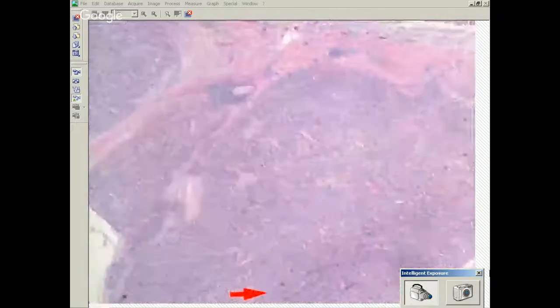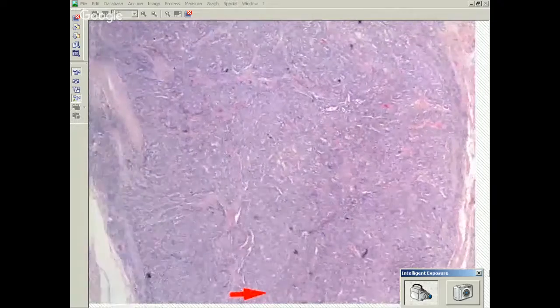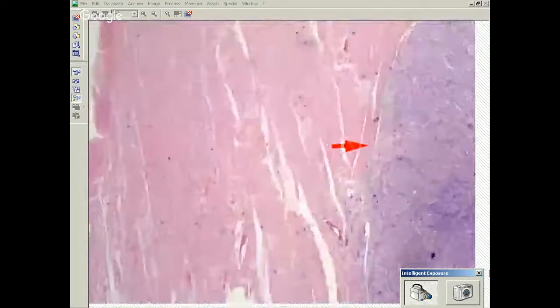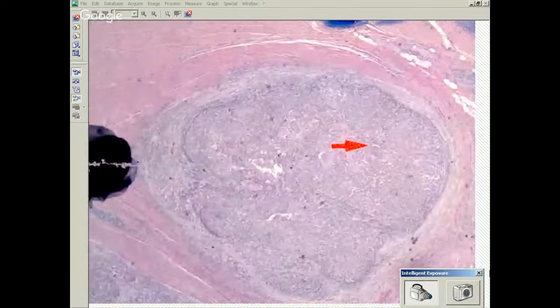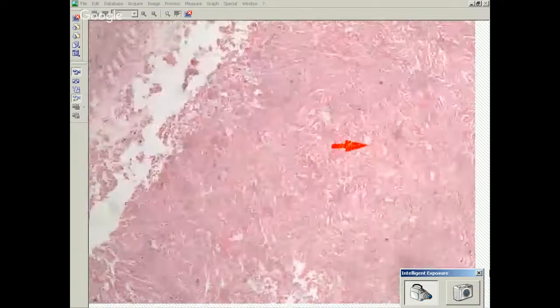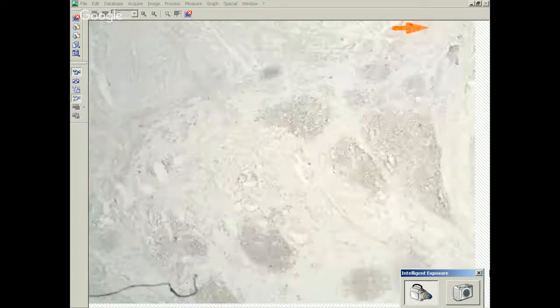Looks a little bit different here. Actually, much more of a traditional component here, but also poorly differentiated. A lot of lymphocytes here as well. So it's poorly differentiated carcinoma with a lot of lymphocytes. It's much more clearly carcinoma. This one was EBV negative. So you can see the tumor cells are not picking up that stain, and it showed a loss of MLH1.